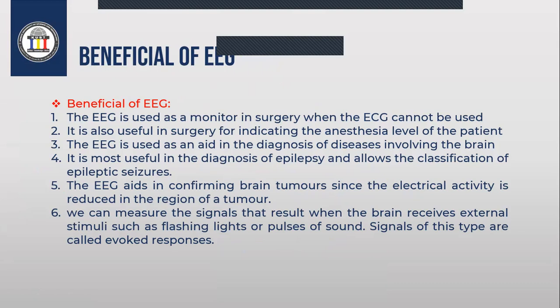Even if the record is noisy and small, we have a benefit of using EEG. The EEG can be used as a monitor of the surgery when the ECG cannot be used. It's also useful in surgery for indicating the anesthesia level of the patient. So if you want to check the anesthesia, you can use EEG.